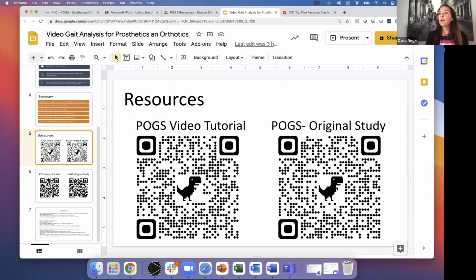And we've got it down to a pretty efficient process so that we can sometimes take those videos when we're doing our 2-minute walk test. We have a loop in our office that we open all the doors and we do our 2-minute walk test. And during that 2-minute walk test, we can also collect the video. So definitely practice on your own, on yourself, on your kids, on anyone. And don't ever try to use the tools in front of patients the first time.